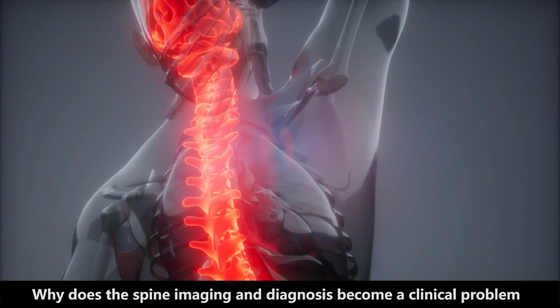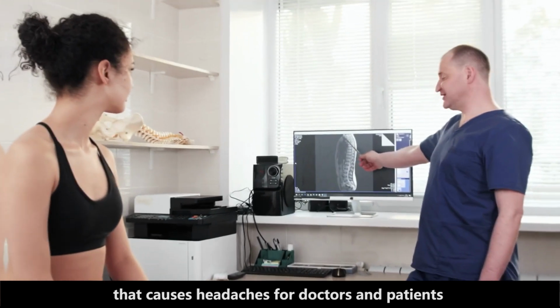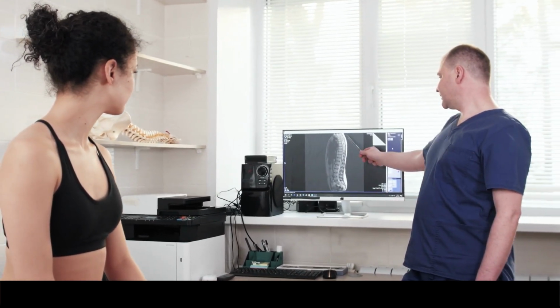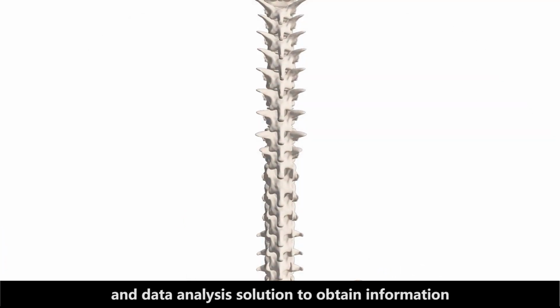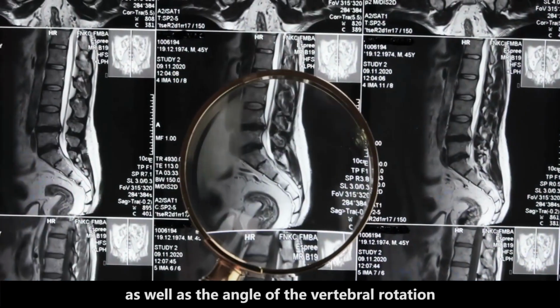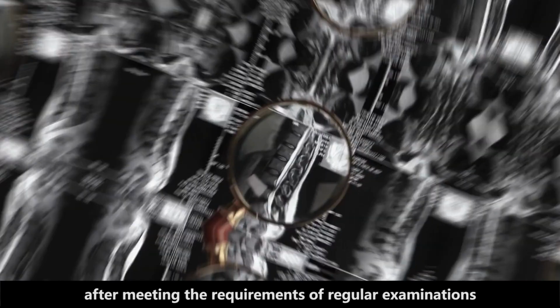Why does spine imaging and diagnosis become a clinical problem that causes headaches for doctors and patients? As early as 1994, bone experts including the Scoliosis Research Society (SRS) hoped to invent a new three-dimensional diagnosis and data analysis solution to obtain information on the spine position and scoliosis, as well as the angle of vertebral rotation, after meeting the requirements of regular examinations.